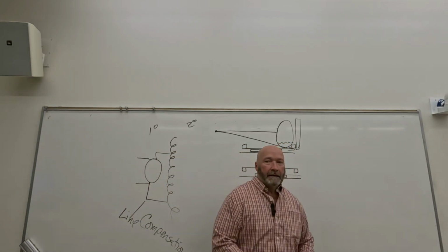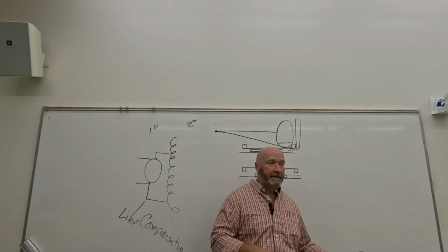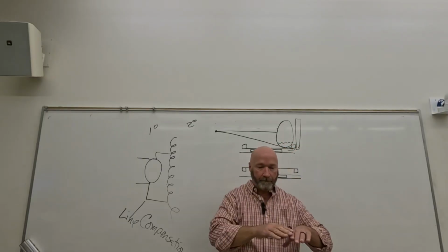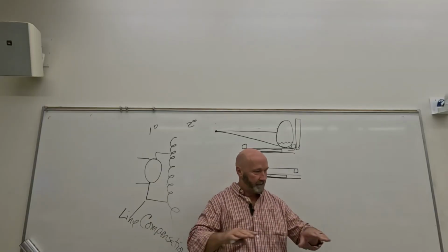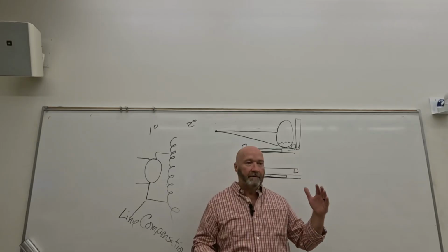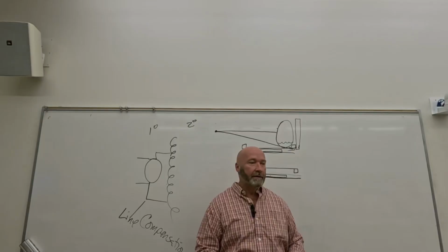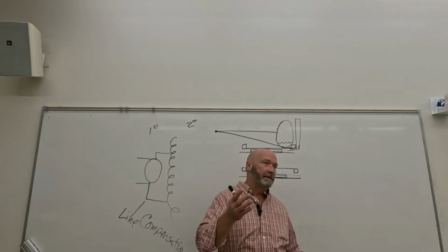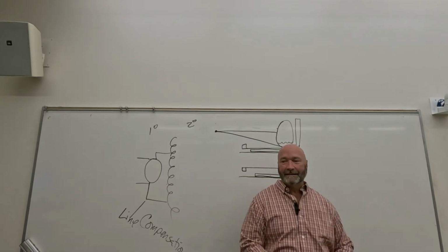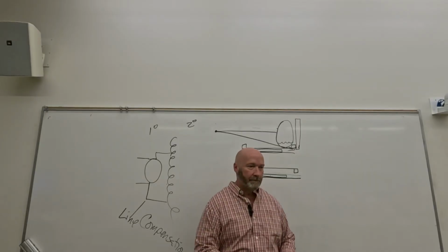So a couple of things about that. One is your fluoro table is going to be identified by its degree of tilt. 90 degrees means the patient's standing straight up. Horizontal would be 0 degrees. If it went 90 degrees in both directions, it'd be a 90-90. You don't see that very often. Probably the steepest Trendelenburg head-down orientation I've ever seen was maybe 60, so it'd be like a 90-60 would be the degree of tilt. But that's how we identify that.